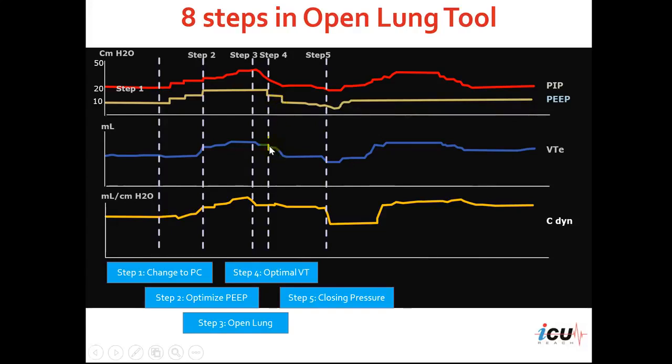We monitor the tidal volume and the compliance, trying to find a value of PEEP that is correlated with a sudden decrease in compliance — that would be the closing pressure. You can notice here at this point, the tidal volume decreased and the compliance decreased. So this is the pressure where the lung closed.